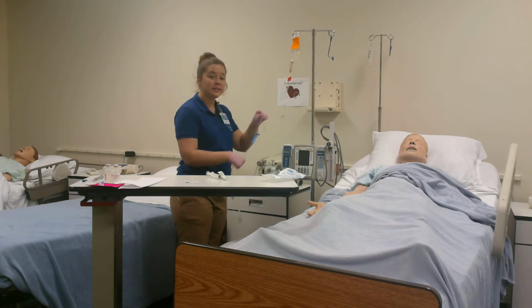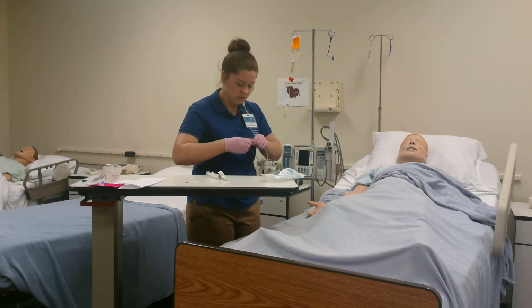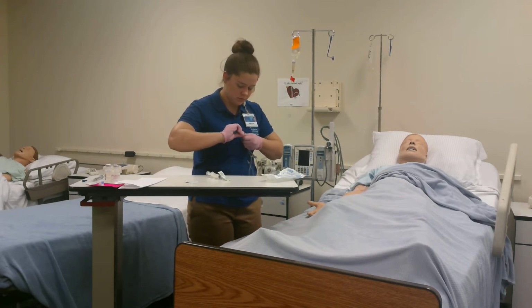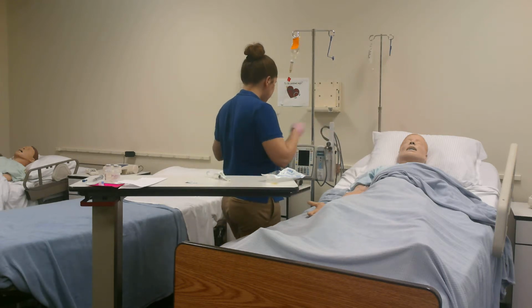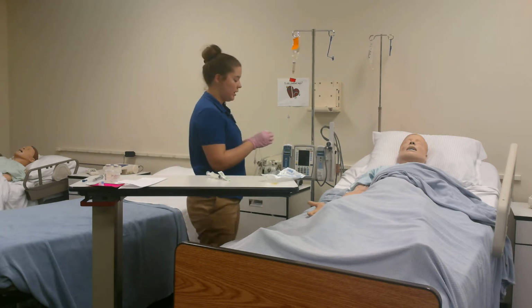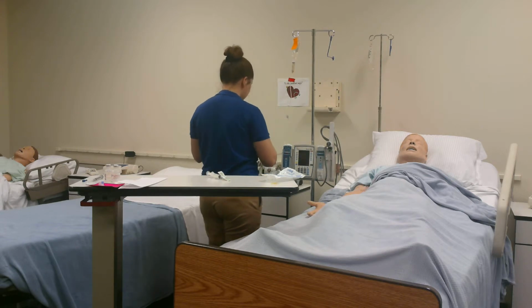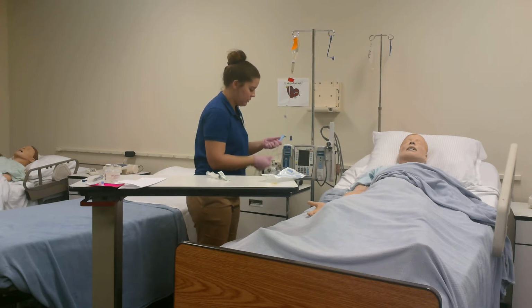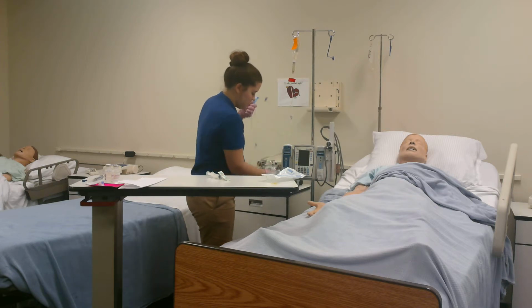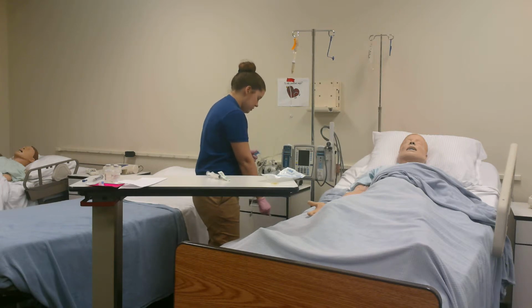And we are just assuming that there's already an IV in place. Okay, and we are going to prime our site. We're going to clamp this down. Okay, unclamp it, excuse me. And we're going to prime the tubing so there's no air bubbles. Okay. Perfect.